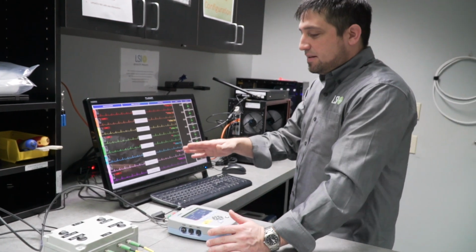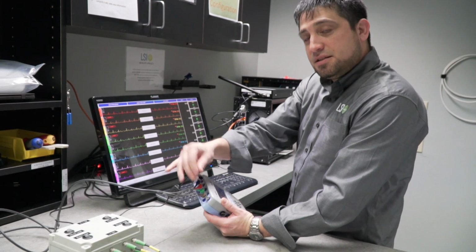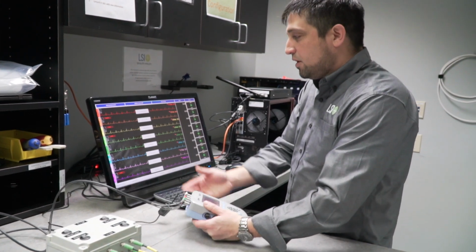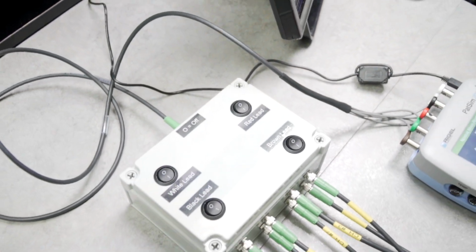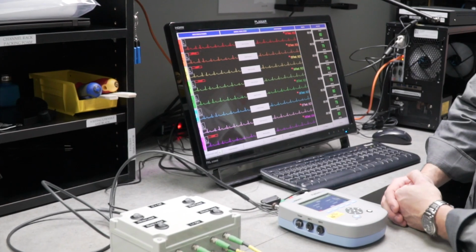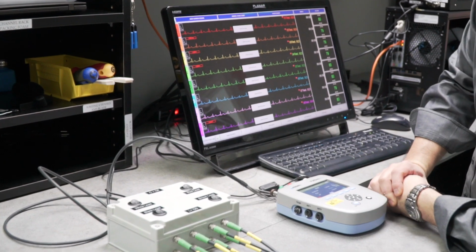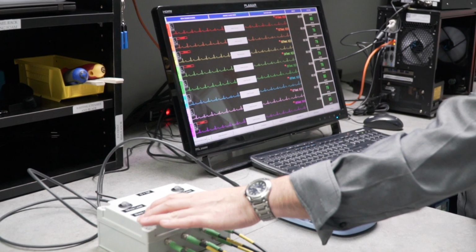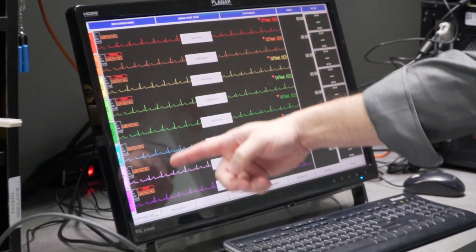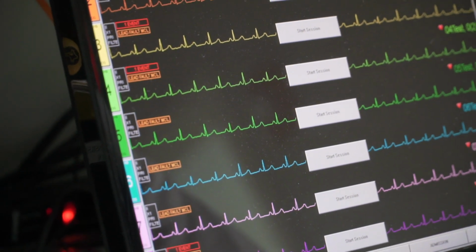We also have some other things that we test because we want to be able to see if, like, a patient's lead gets disconnected. We want to know that it's not a failure, but rather some sort of lead problem. So the black and brown leads are called MCL leads, and then the white and red leads are called lead 2. Those are medical terms. So if we disconnect the black lead, we should see an MCL fault pop up, which we do. So that works as expected.